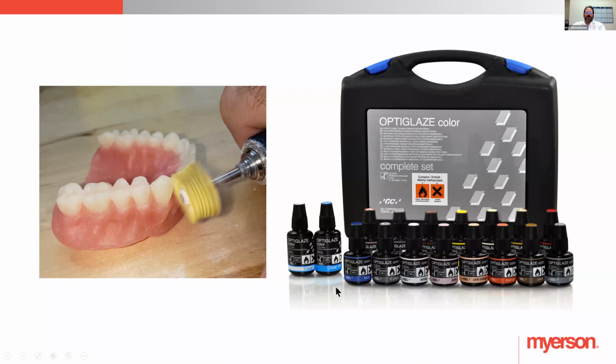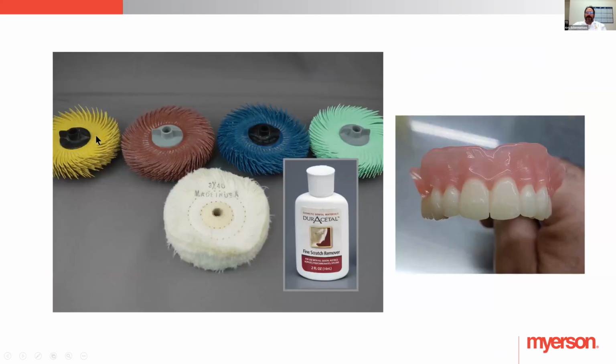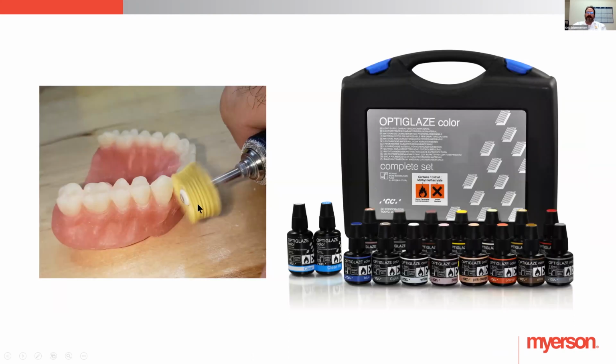OptiGlaze, I'm loving more and more. Really love those kits. Again, I'll go over with the yellow. They also make a handpiece size. Those were for lathe size. This is for a handpiece size. Go over the surface, get it how I want it.